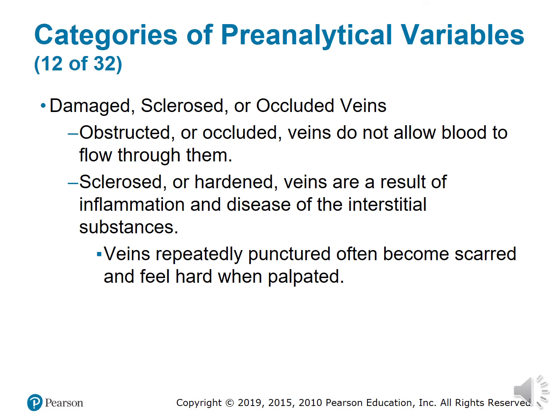Eventually what's going to happen is all that air going in and all that pressure, the blood rushing up against that site, is going to get hard. And over time, it won't be where you can just slide the needle in. The needle itself, as sharp as it is, won't just break the skin. You're going to have to apply a little bit more force to break through that scar tissue, and you have to be mindful of that, because that scar tissue could break off and get caught in the bevel of the needle, causing a clot and preventing blood from flowing. Again, the lines will become occluded, so you just have to be mindful of that.